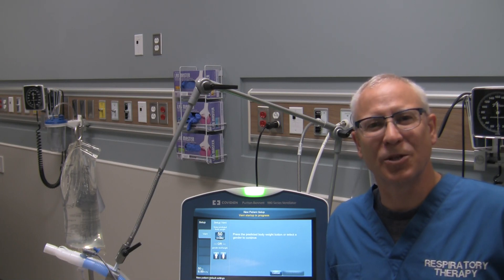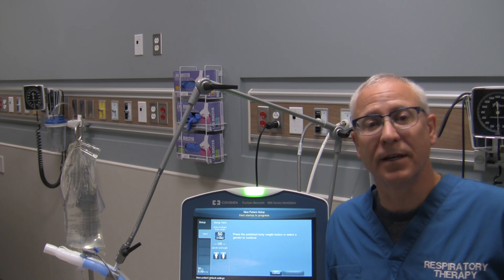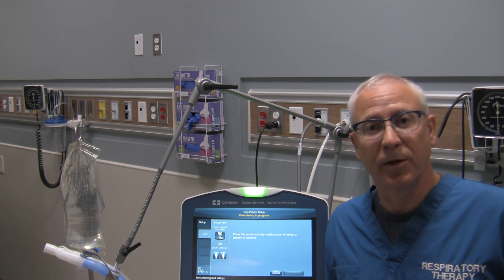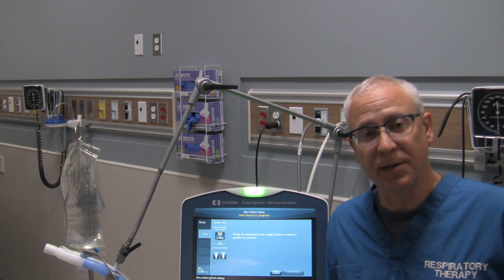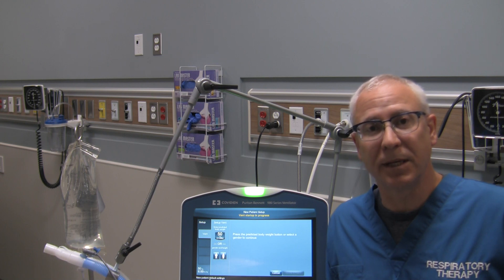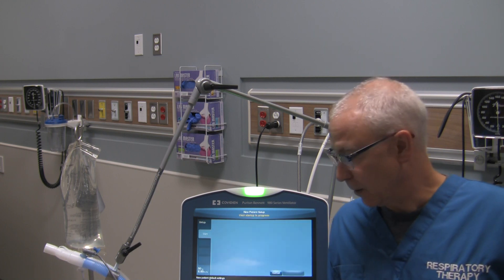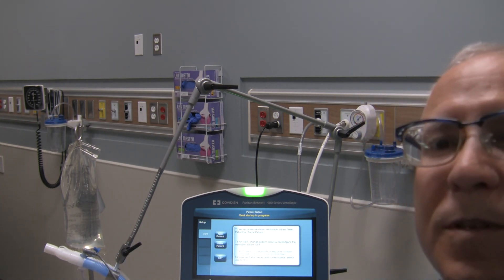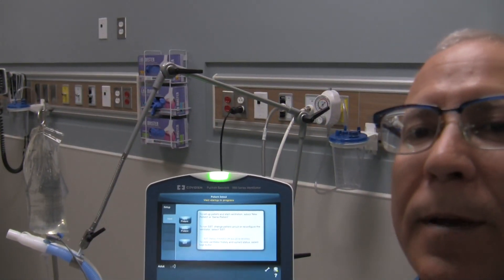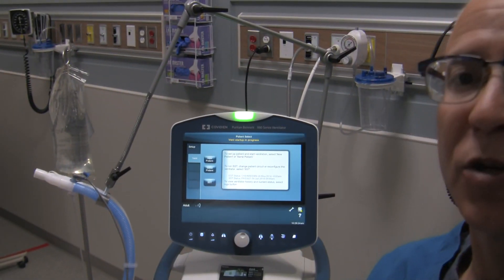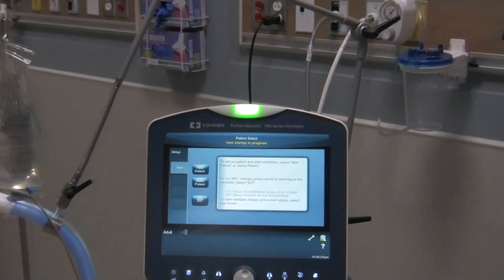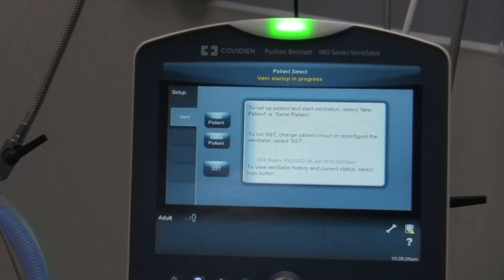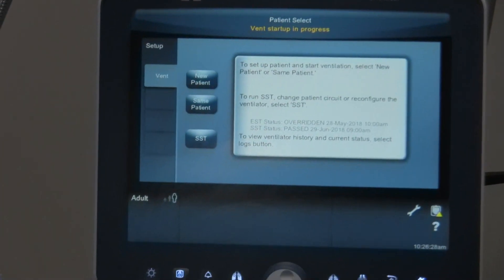My name is George and what I'd like to do is show you in this video the basic screen when you're going to initiate mechanical ventilation on a patient using a Kvidian PB980 ventilator. To zoom in on the screen we'll just move the camera a little bit and show you how to accomplish all that.